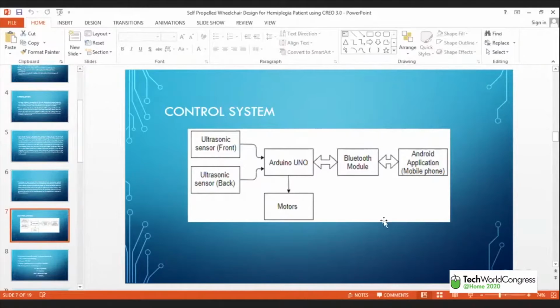There are certain things which I have not shown here. For example, when we considered the patient we had for our reference, we also implemented a small torch on the left arm side where the person could have access, right? The torch was meant to ensure that minimum light is available in case there is a light failure. And even if there is not a light failure, even in day to day life, when the transition from day to evening or day to night is happening, the person has a provision to use a small source of light if needed, right?